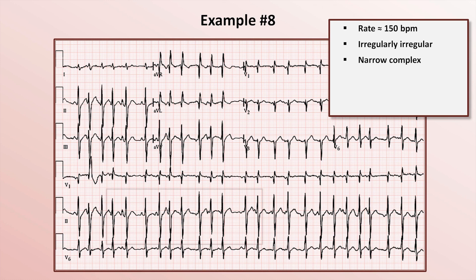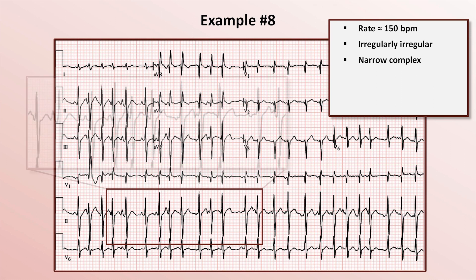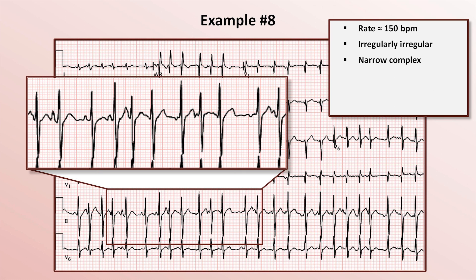Let's zoom in on lead 2 in the rhythm strip. There is clearly a small, discrete waveform before most of the QRS complexes. These are P-waves, but there are many different morphologies, and no one morphology seems to be particularly predominant.